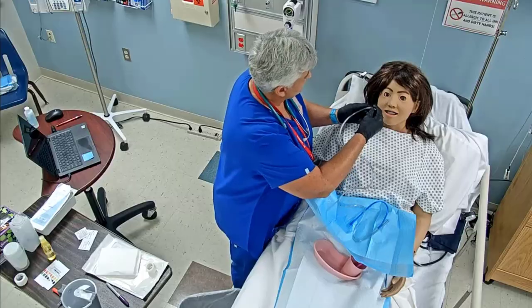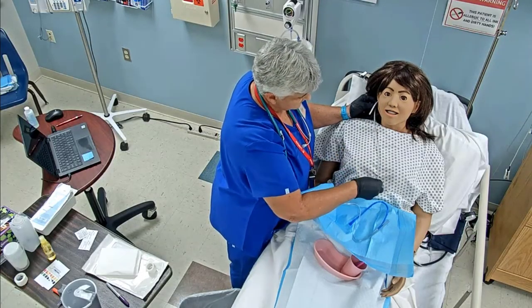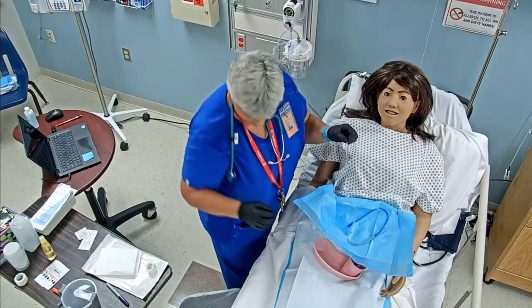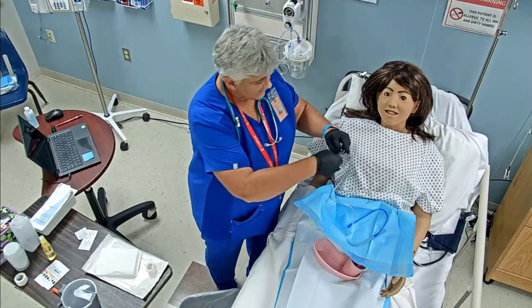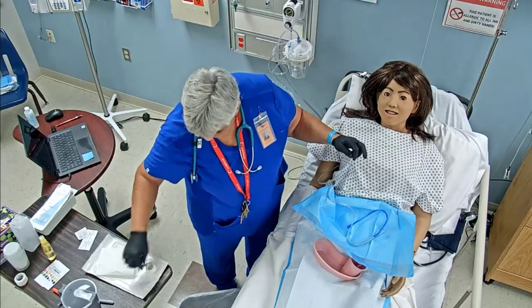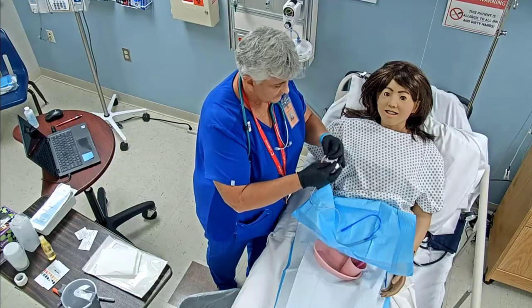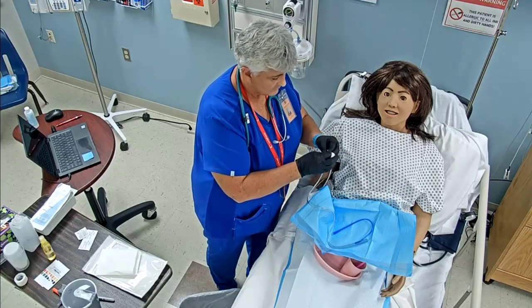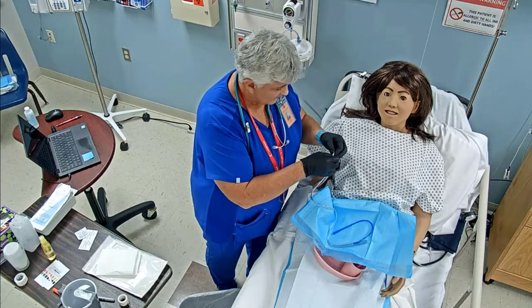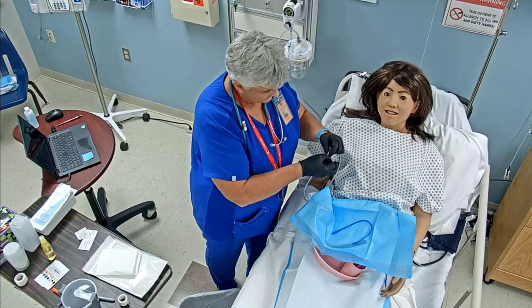So we're going to go from your nose to your earlobe, okay? And then we're going to go down to the xiphoid process, okay? Right there is where we are going to either use our marker to mark it, or we can use our paper tape, one or the other. So that way we know how far to put your tube in.